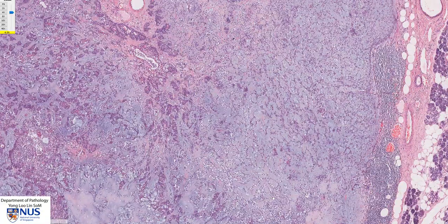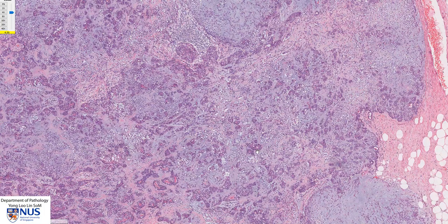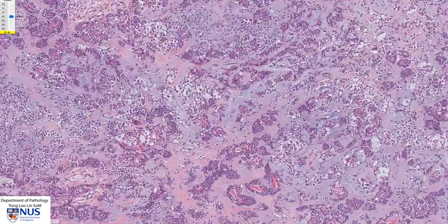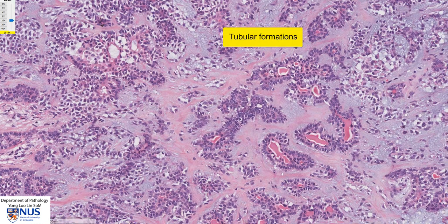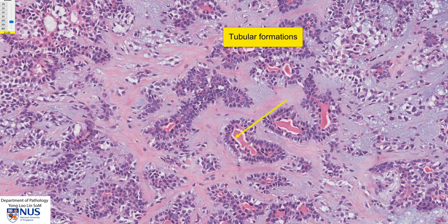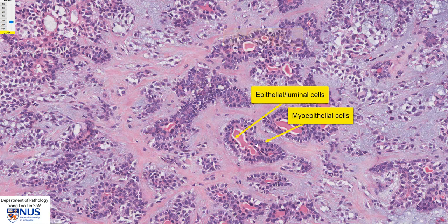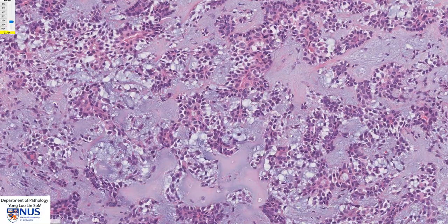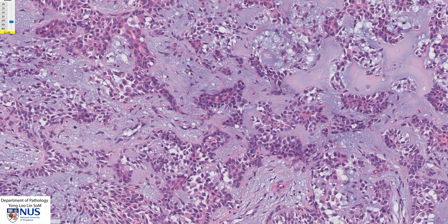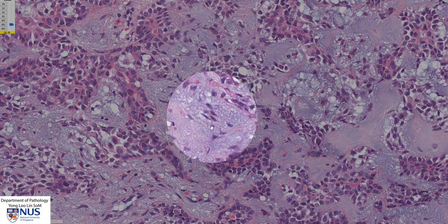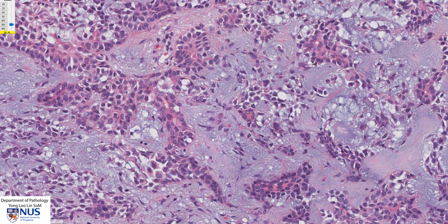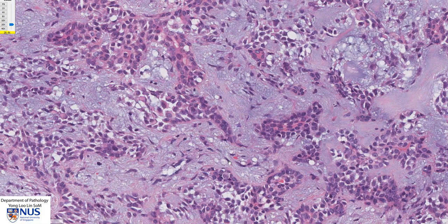In addition to this chondromyxoid stroma, there are many cells that form a variety of structures. In this area, we can see tubule formation. The tubules appear to be lined by an inner layer of epithelial cells, surrounded by an outer layer of myoepithelial cells — so we can see some bilayered tubular structures here. In other areas, the cells seem to just melt into the stroma, and these cells are also derived from myoepithelial cells. Their shape is a little different in the myxoid stroma — they tend to have tapering cytoplasmic processes and are sometimes very spindle-shaped with slender, elongated nuclei.